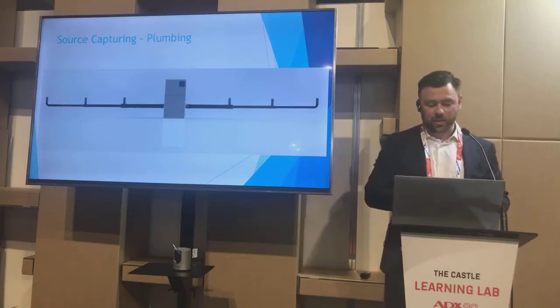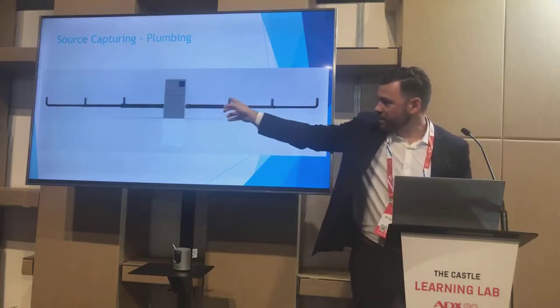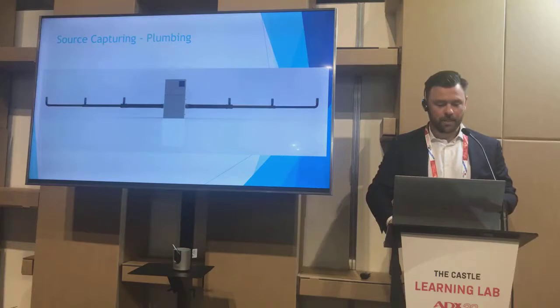As you can see in this picture, over here is a smaller pipe, and it gets a little bit bigger as you go down, but it's a small pipe going up out of each individual station. So it's very important to have that balance.